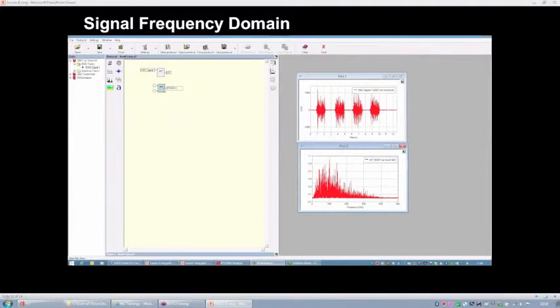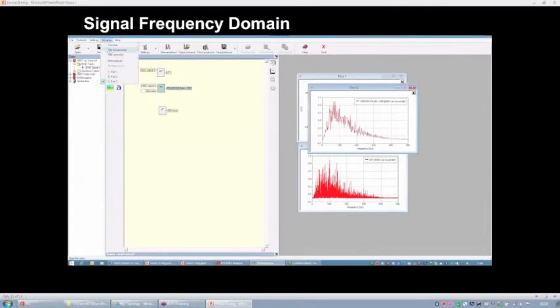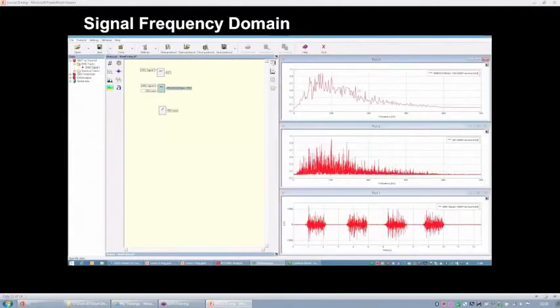In this case, you have to put two inputs instead of one. The first has to be the raw signal, and the second, the duration of the time epoch. So we will use 500 milliseconds. So the signal, and this is the result. Okay, so now you should have learned how you can compute the spectrum of the signal by means of our application.